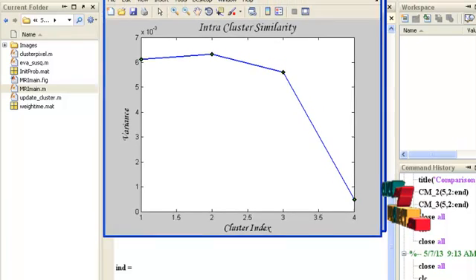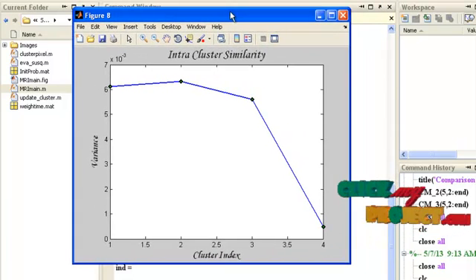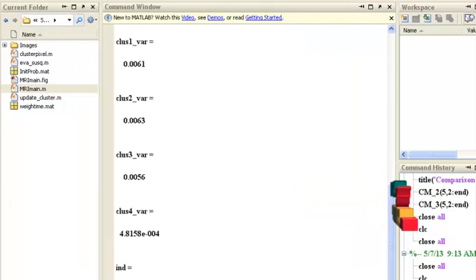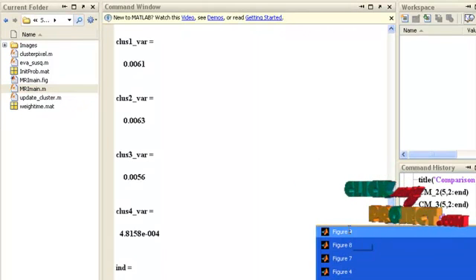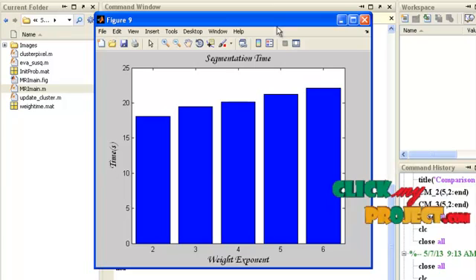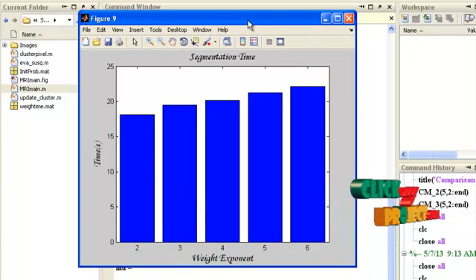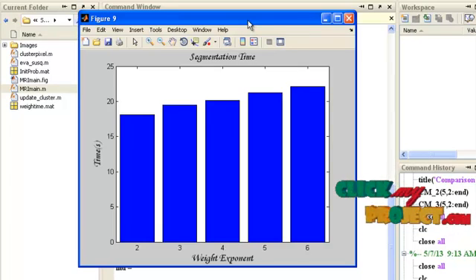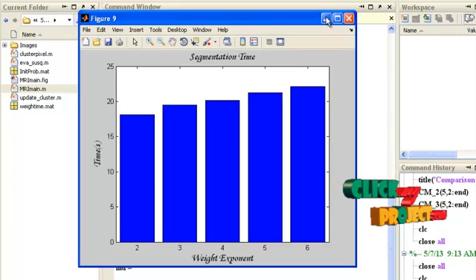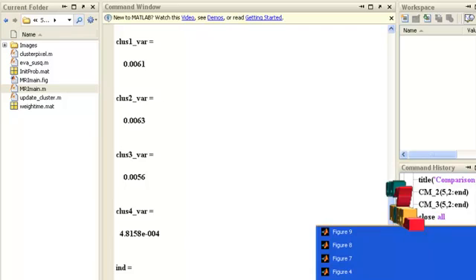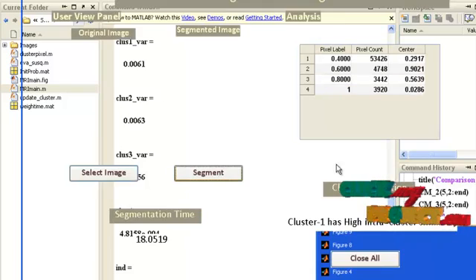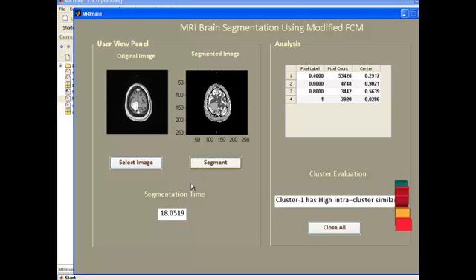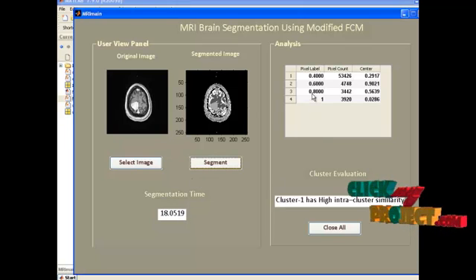This graph shows the intracluster similarity — variance against cluster index is drawn here. This next graph shows the segmentation time for various weight exponent values, with the corresponding time measure displayed. The overall results are displayed in the main GUI window, including the segmented image in grayscale format and segmentation time.